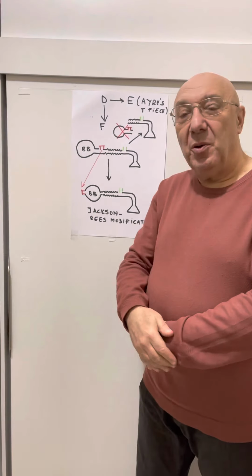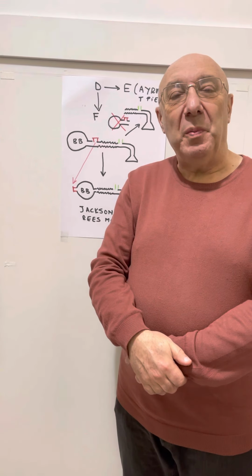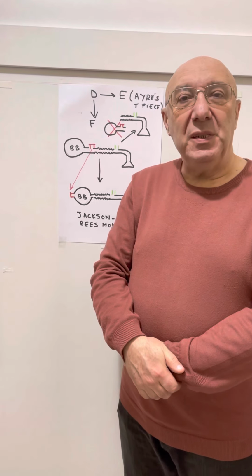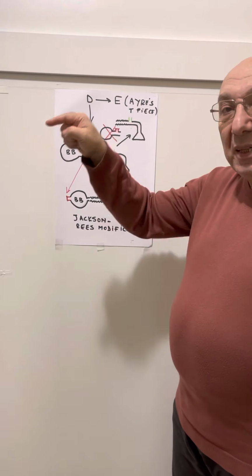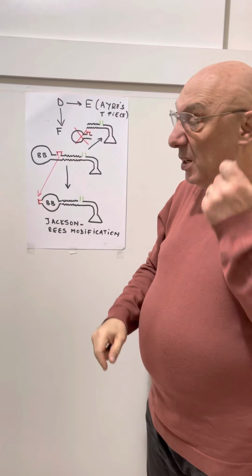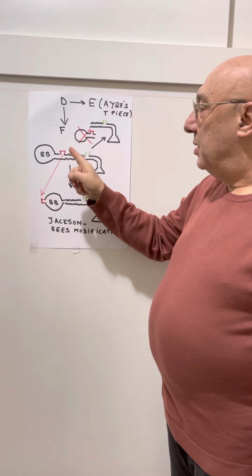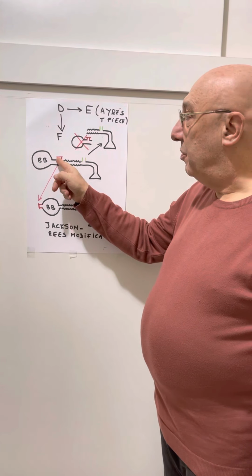This is our last meeting discussing the Mapleson classification. We've been going through A, B, C, and now we finally got to the D, the last vertical one before the final classification. So this is Mapleson D. You remember this is the fresh gas inlet and this is the pressure relief valve.